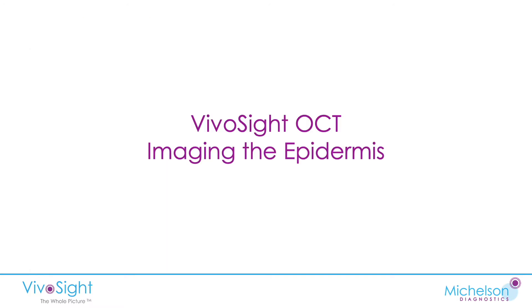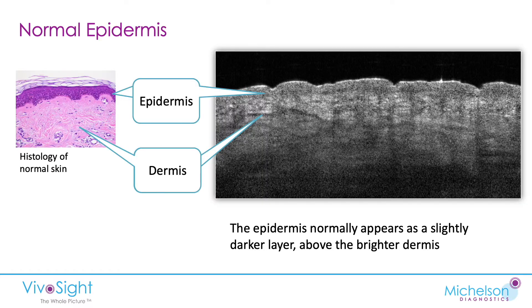So how does VivaCite OCT image the epidermis in particular? VivaCite OCT sees it as a slightly darker layer of tissue. We can see it here on this image of normal skin — there's a distinct band of darker tissue above the dermis, which corresponds to what is seen in histology: an epidermal layer above the dermis. The stratum corneum, which is extremely thin, is visible only as a very bright top layer.